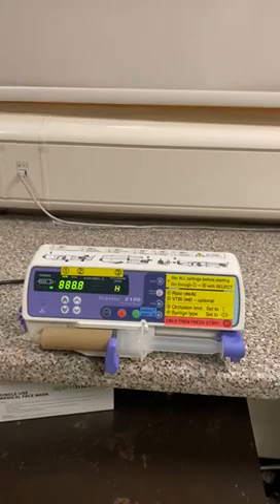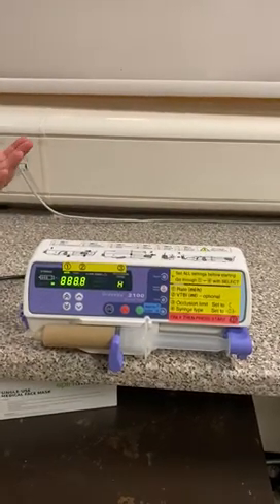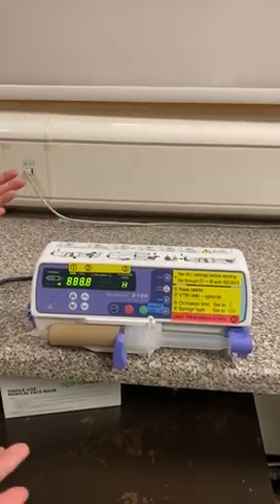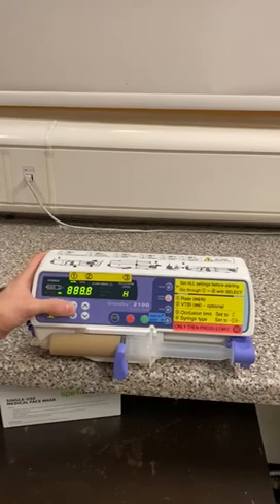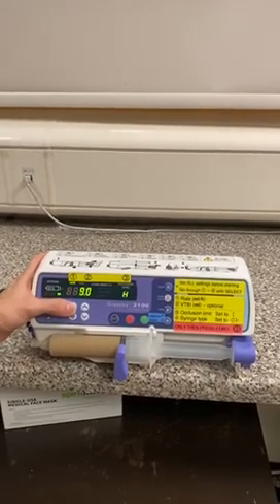There are four things we need to set on the pump. The first is our rate in mils per hour. Let's say we're giving 100 milligrams an hour of propofol at 1%, which means that's going to be a rate of 10 mils per hour. Mils per hour is highlighted right now, so all we need to do is set to 10 using the arrow keys. We go up to 10 and that's set.